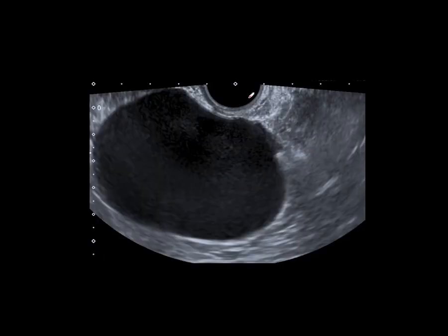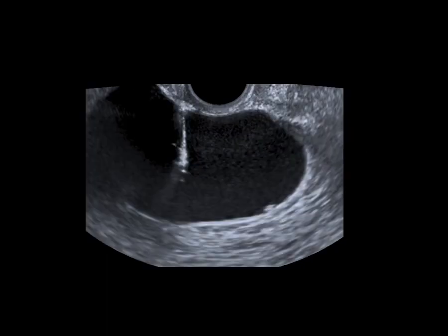So took her in for a transvaginal scan, and I looked at this and I thought, well, sometimes lymphomas are very low echogenicity. It probably just is still lymphoma, but I was slightly doubtful. I thought I'd better just put my local anaesthetic needle in all the way to see it, just to check it was solid, but in actual fact it was cystic.